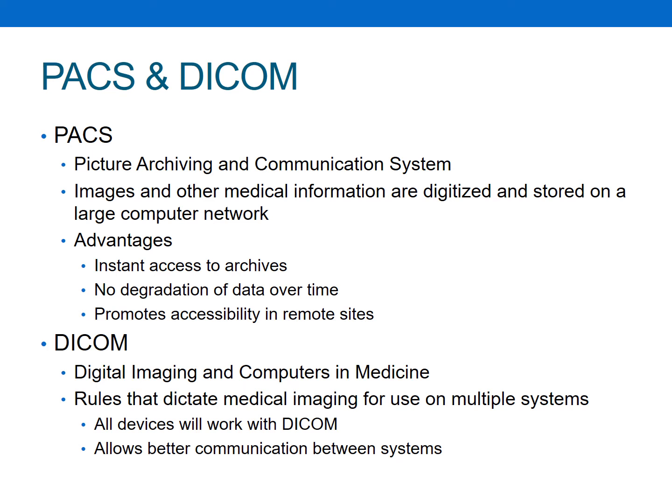If you were to save pictures on like paper or on films, they can start to get smudged, or they can start to fade, and they're just not as stable as they are in the PACS system. And then the PACS system also promotes accessibility in remote sites. So you can have a radiologist sitting up in Duluth reading pictures for somebody down in the Twin Cities. It just offers much more portability and accessibility in between hospitals and clinics.